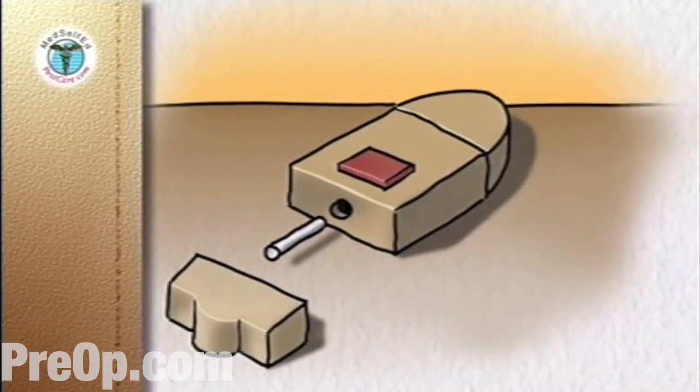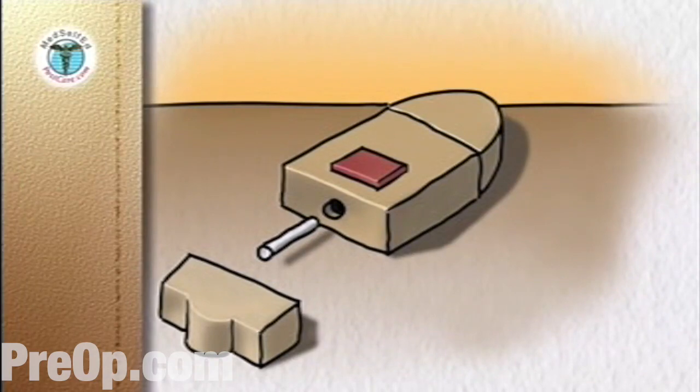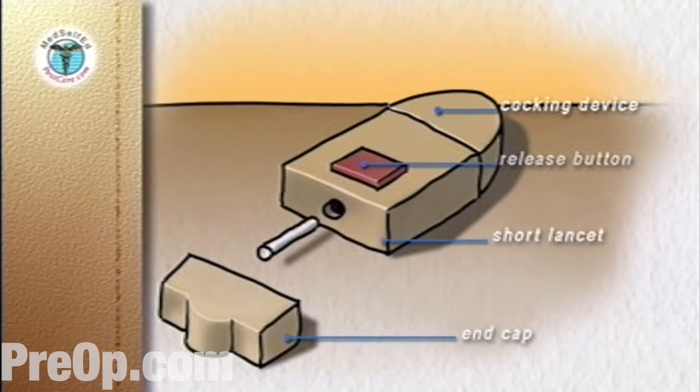The automatic lancing device has three components: the body with a release button, lancet holder and cocking device, the removable end cap, and a separate short lancet.